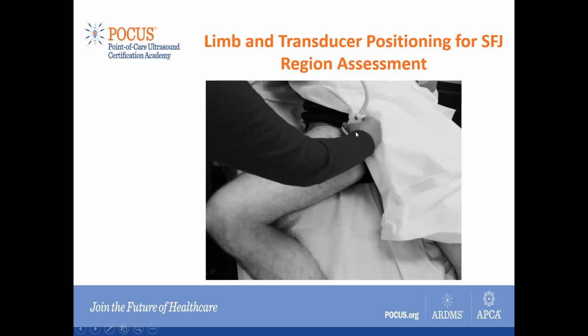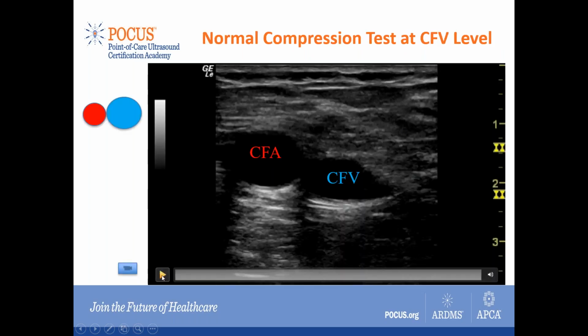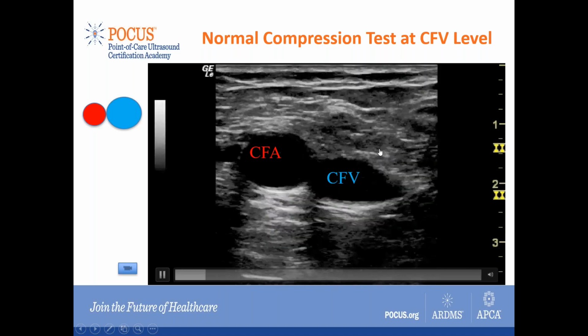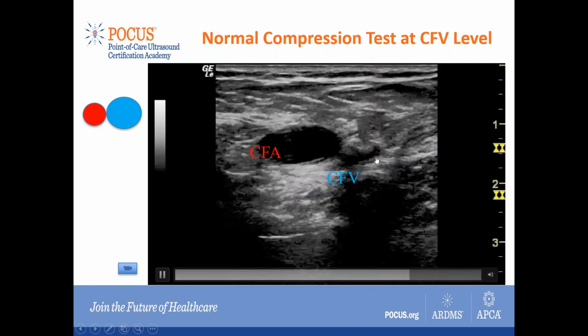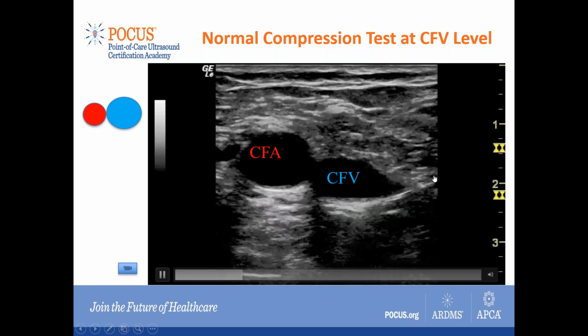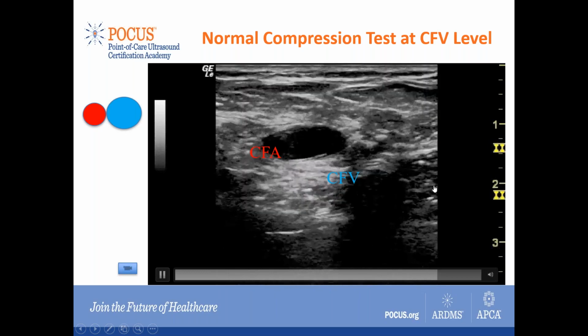Here's another view showing you external rotation and flexion of the knee. I'm going to show a video so you can get an idea. So we're putting pressure, and you can see the vein is completely collapsed, and so there was no thrombus present. Essentially, you want to move 1 centimeter below and do the exact same thing.